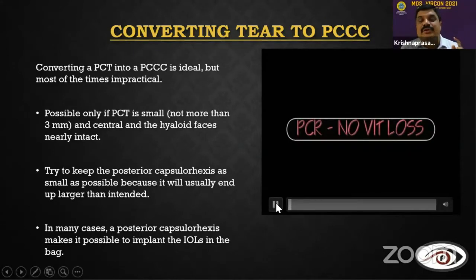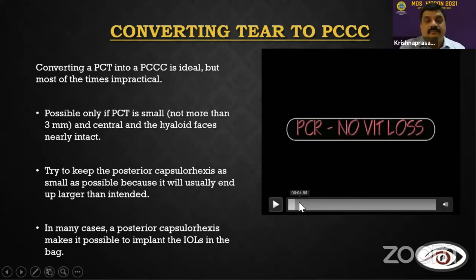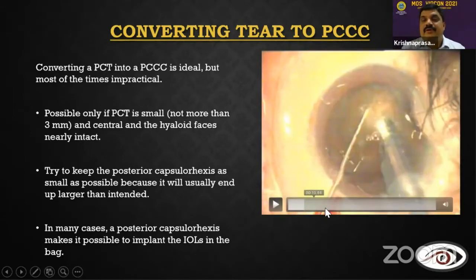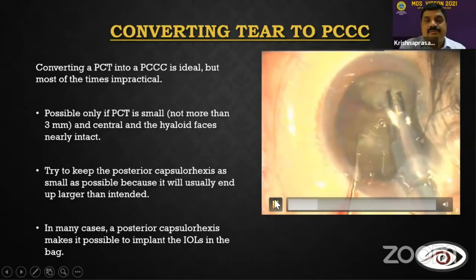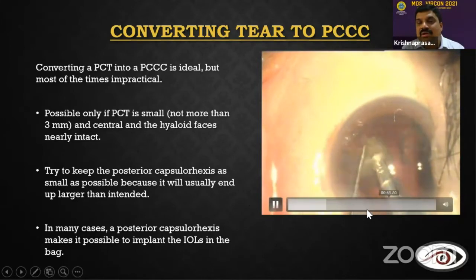So here I'm just showing you one of the old videos of one of my friends. See here, you can see here. The phacoemulsification is proceeding very well. And you can see in the end of the surgery, there is a small rent here.